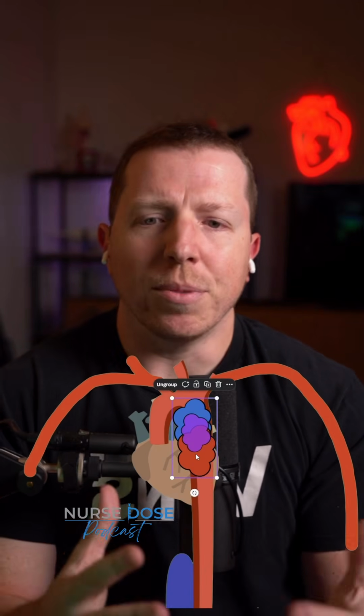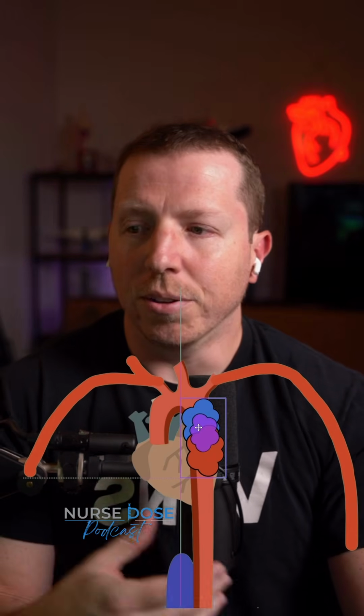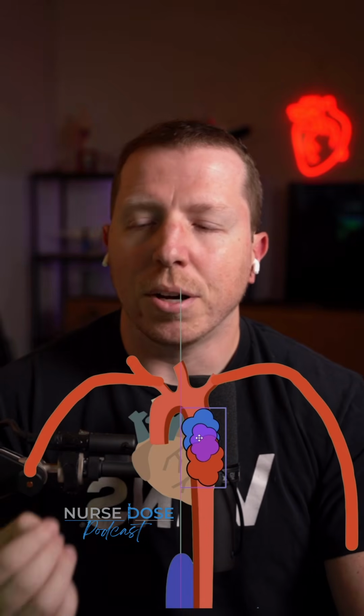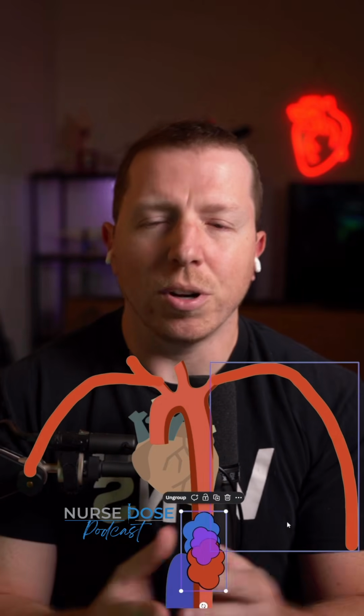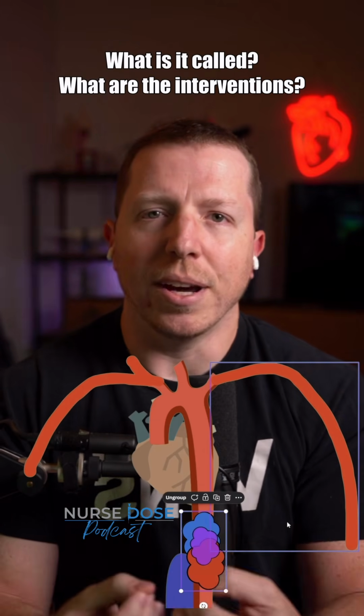So now I want y'all to tell me what happens if the lungs are not doing very well. They're not oxygenating the blood very well, but the heart starts pumping out more of this poorly oxygenated blood, and we start seeing the mixing cloud go farther down. What could we see? And after what we've talked about, what would you expect to happen?